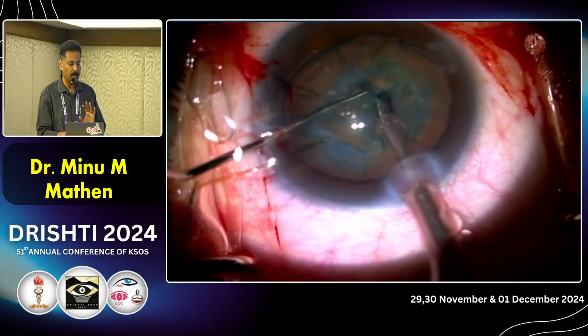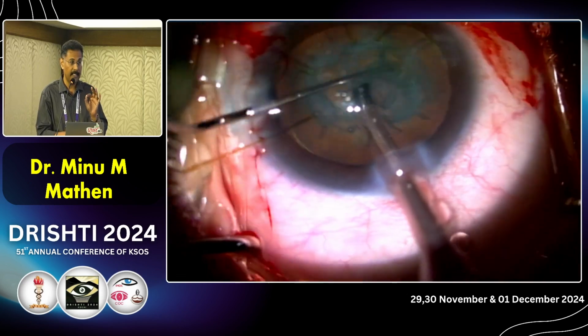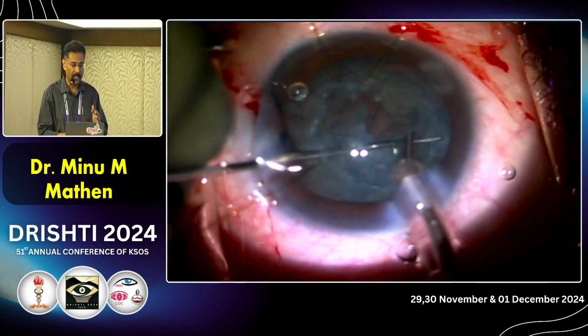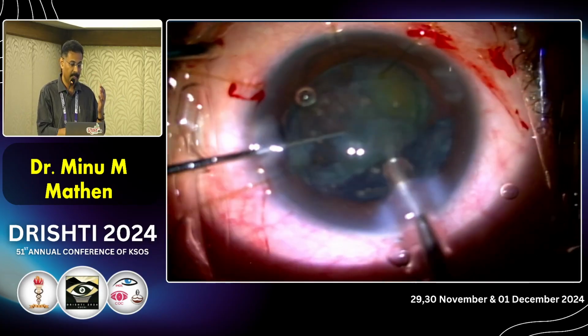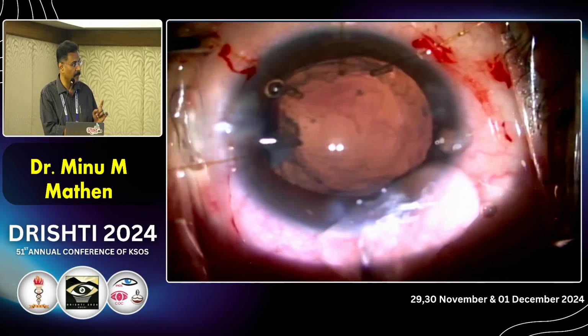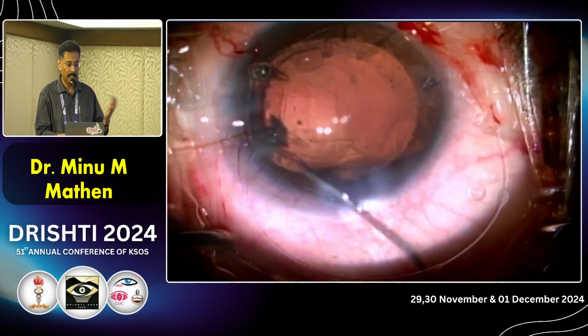And then the technique is going to be the same but everything is slow. Do slowly, but the energy has to be adequate for the type of nucleus. Don't reduce your energy. But your flow rate and the irrigation, everything has to be slow. And then the phacoemulsification happens as routine. Once that is finished, fill up the anterior chamber and then only exchange. So you don't want things to shallow and get more vitreous out.